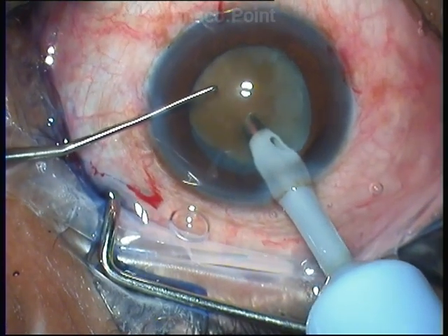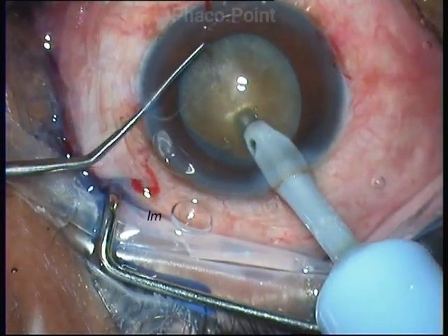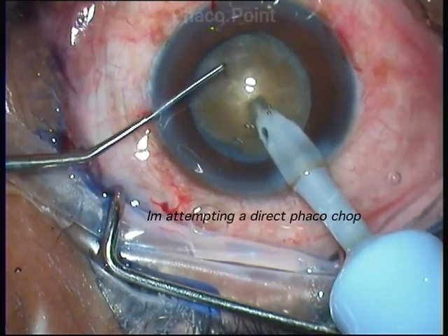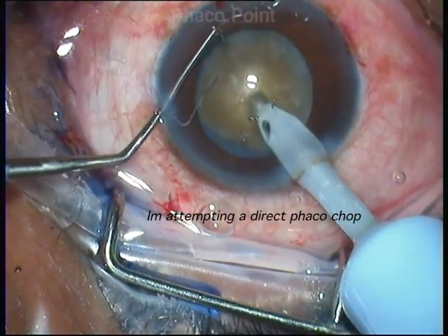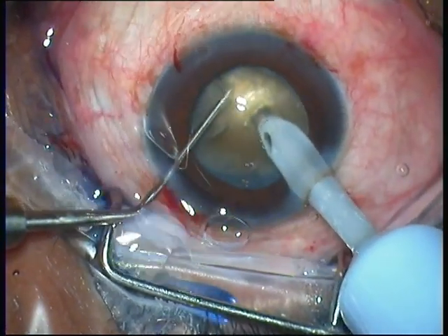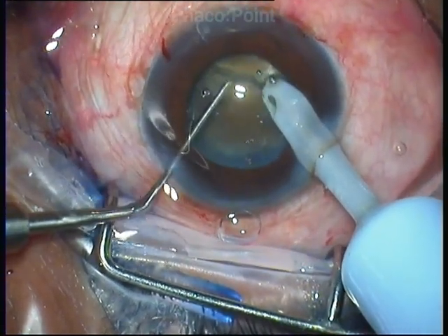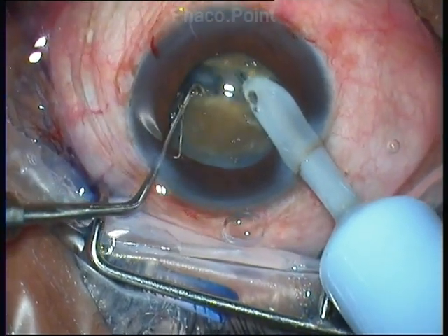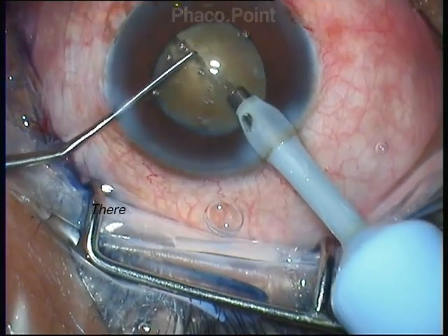I am attempting a direct phaco chop using a 1.75 mm sharp tip chopper, which is my technique of choice in handling all types of cataracts. I need to bury the phaco tip quite deep within the nucleus, and a considerable amount of energy is needed in order to initiate the crack in this particular nucleus.